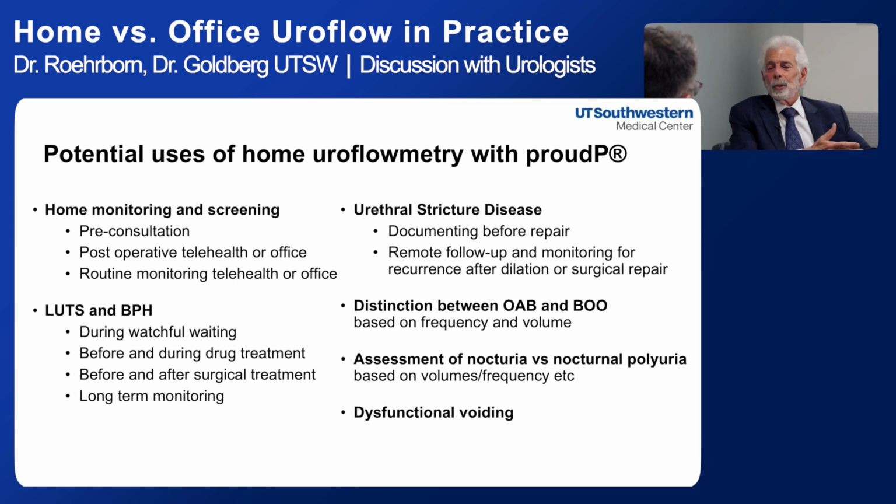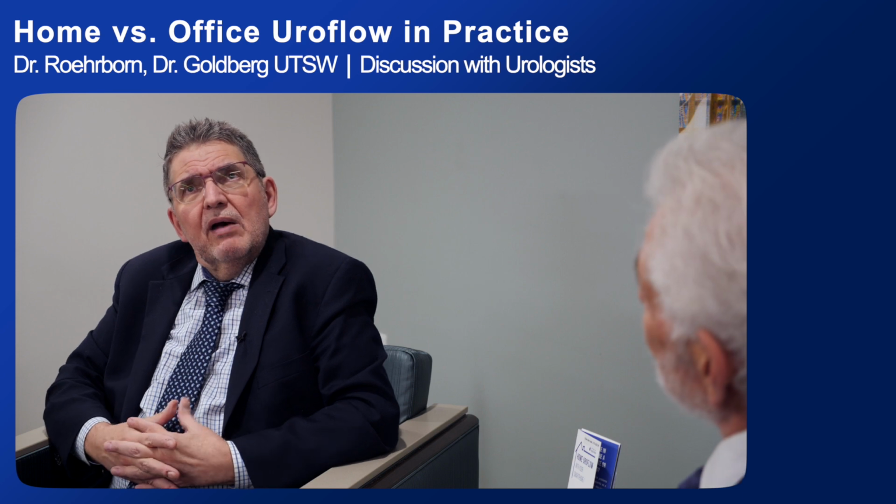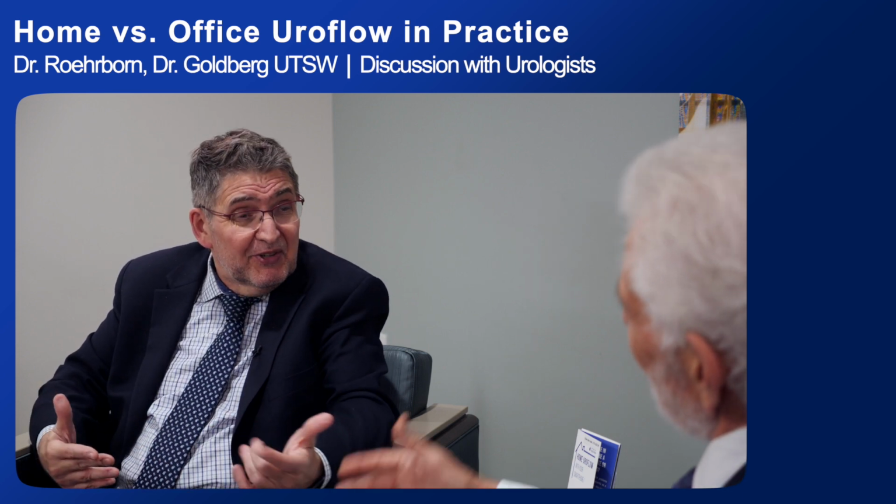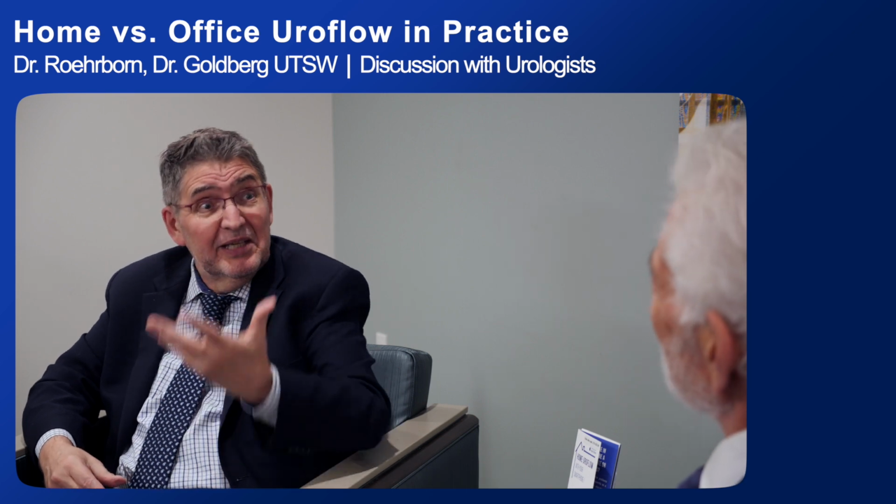We get the pre-procedure flow rates, we start getting them after his catheter's been removed, and I can monitor him and determine when to get him off alpha blockers, when to get him off anti-inflammatories, and how he's doing at 3 months, 6 months, and so forth. I find that works well from the point of view of convenience and keeps patients out of the office. So you have a vast number of flow rates. When you say you, it's actually your patients who have them, correct, but it's in your database on the web.